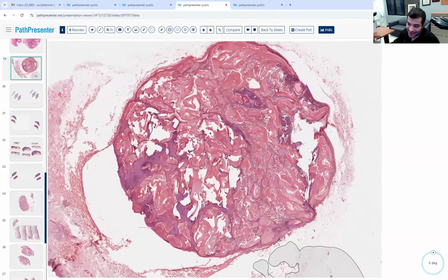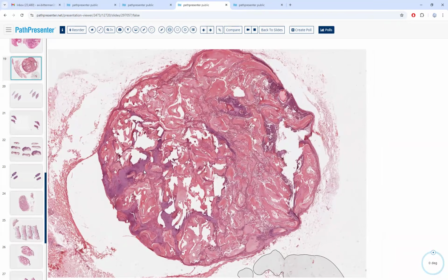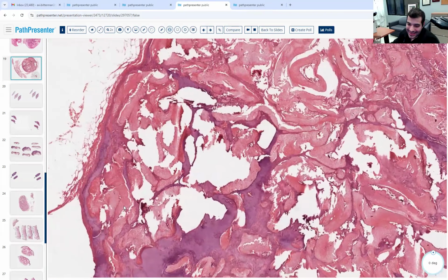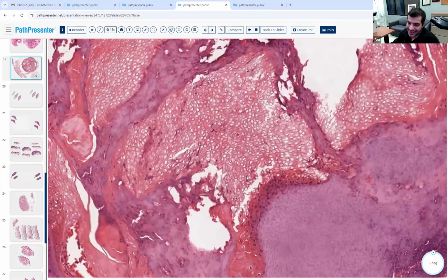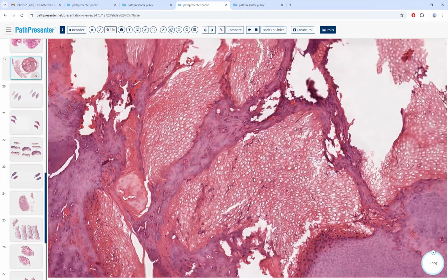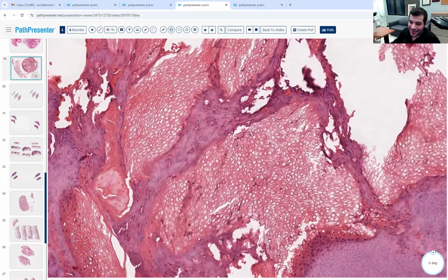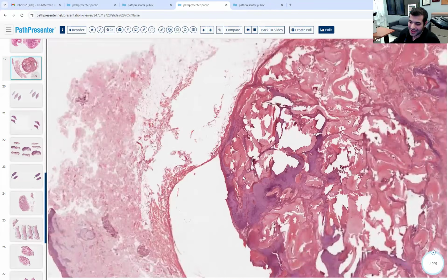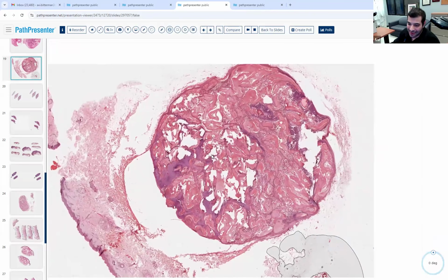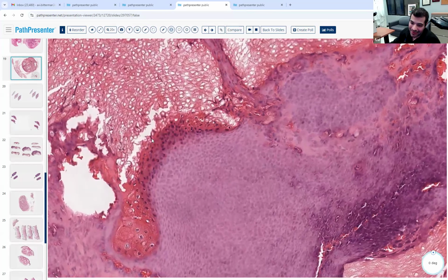Whereas this, we can already see the tissue here. This is more pilomatricoma. Yeah, it has that salmon color resembling those ghost cells, and we can even see them over here. We can also see the transition. Even from lower power, there's also this other thing I'm seeing, these areas now. Proliferating pilars can calcify, so I'm going to go in here, but I'm suspicious this might be matrical tissue. And I'm going in, and then I see, oh look, you see, everyone see this transition.